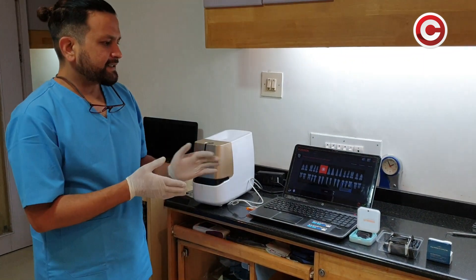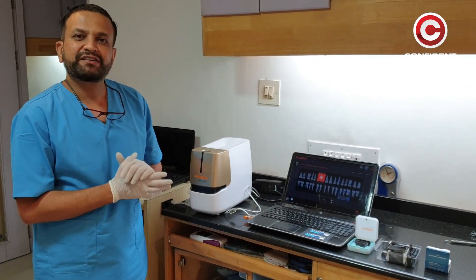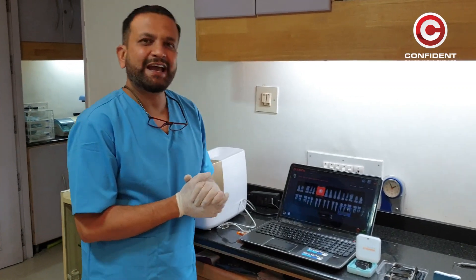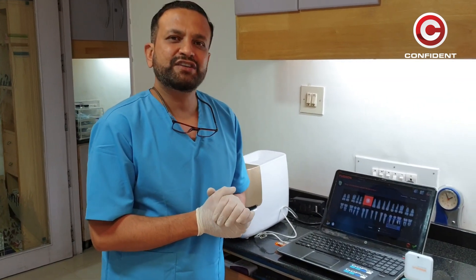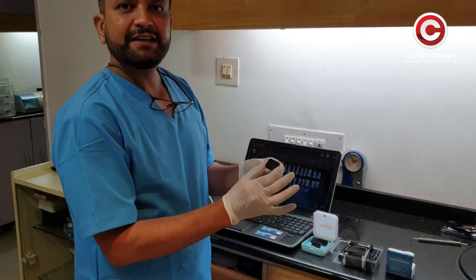The Phosphoplates and their relevance is even more important in these times of COVID, where we are trying to prevent cross-contamination between patients and ensure the dentist's safety too. Now, we are going to choose a PSP plate size number 1.